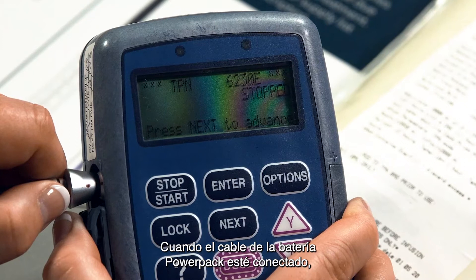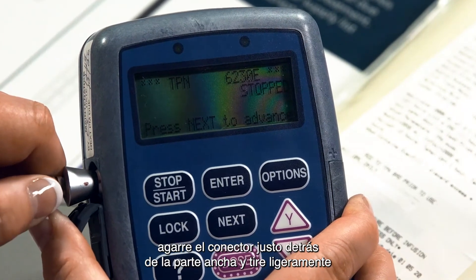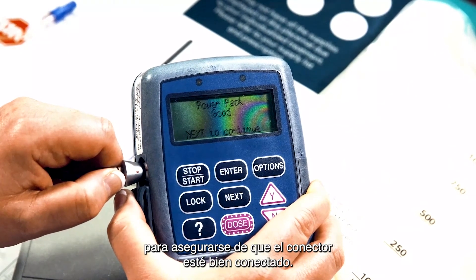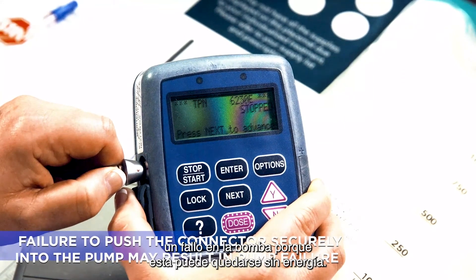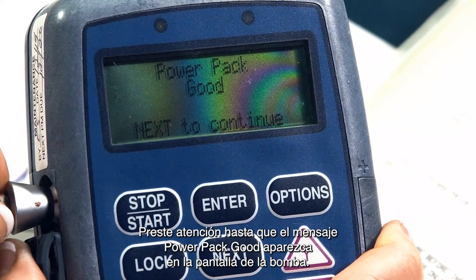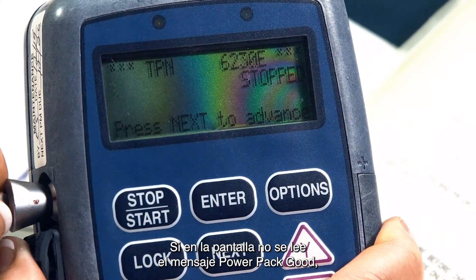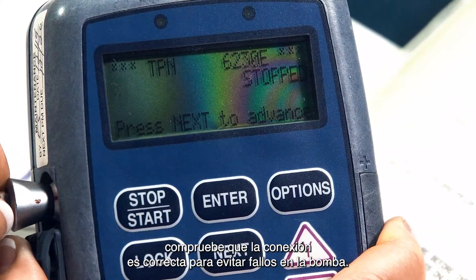Once the power pack cord is connected, grasp the connector directly behind the flared portion and lightly pull to ensure the connector is securely attached. This is important because failure to push the connector all the way into the pump may result in loss of power. Watch for the message "Power Pack Good" on your pump's display. If your display does not read "Power Pack Good", double check the connections to prevent pump failure.